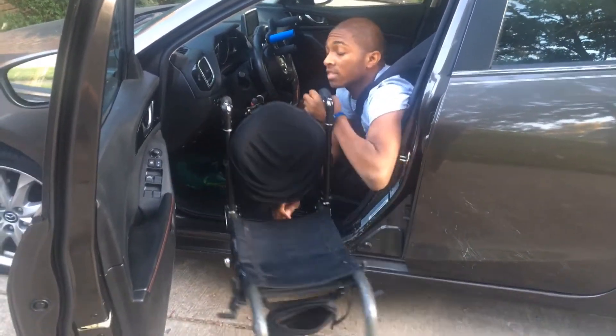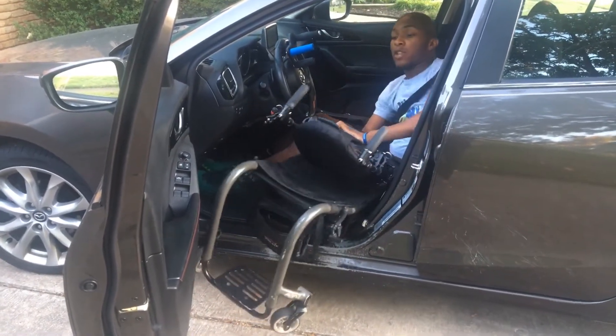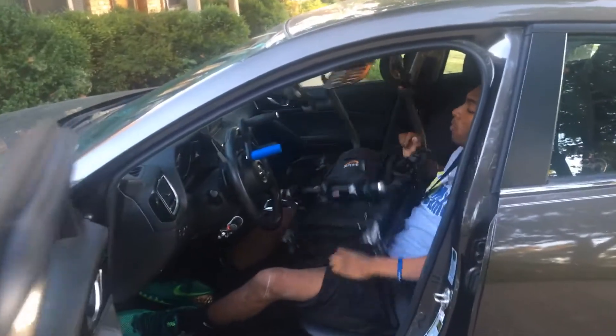Unlock the chair, take the wheels off, put them in the back. Here's the tricky part — this chair folds down, there's a lever in the back, push that down. Then I'm going to lift it up over my body and into the passenger seat — you're going to lift it completely straight up all the way back.